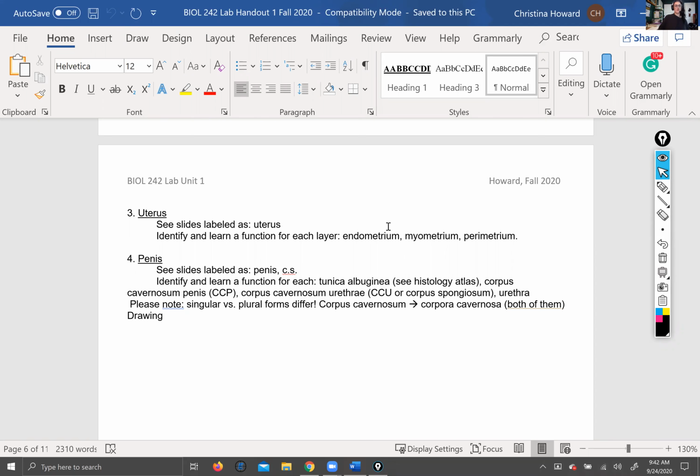So you need to be careful and make sure that you're reading the question being asked and not getting excited and just typing in what you see before taking the time to understand what's being asked. That's another error I see frequently, is students kind of firing off an answer before actually taking the time to stop and take a breath and read, which is a big mistake. So don't do that. Okay, so we're gonna go look at the uterus and you need to identify each layer.